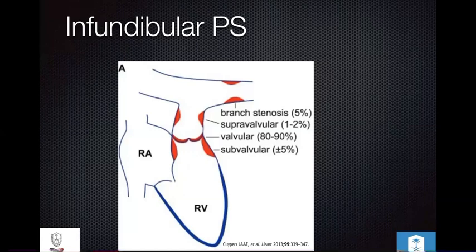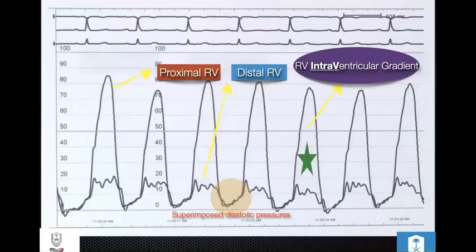So if you go methodologically, if you try just to look at pattern recognition, it's really not helpful. It doesn't come out clean like in the books. This is reality. It comes with a lot of artifacts, and you have to collect data in a way that makes sense. And this is a good exercise in how to identify what type of chamber based on the approach we talked about earlier.